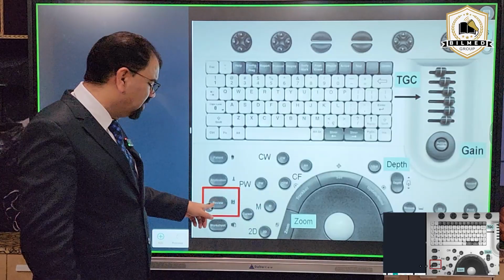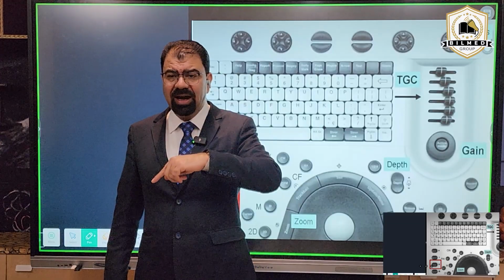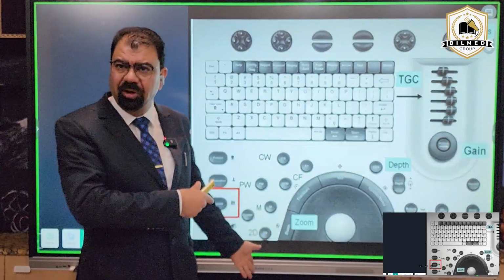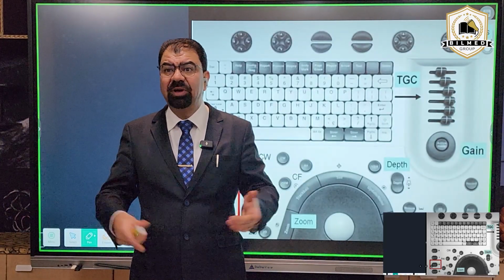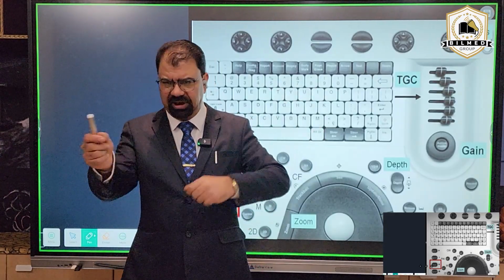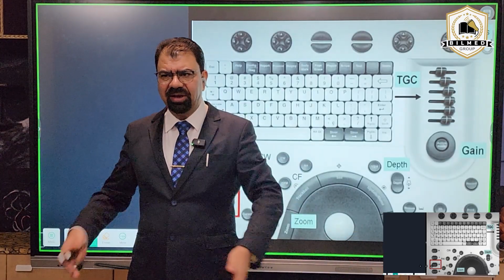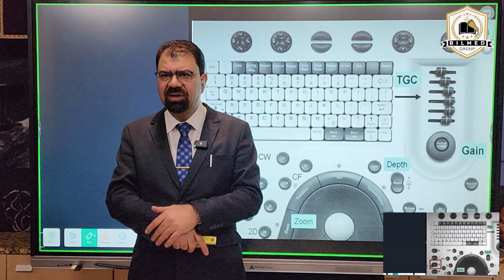Now, if you choose a preset of abdomen, try to understand. If you choose a preset of abdomen, you will tell me, why should I? But when you are pressing haphazardly here and there, there are chances that you are hitting that preset without actually intending to. Then you are searching for the CRL. Why is it not coming over there? I have to take a CRL. You have accidentally given a command to the machine, I am about to scan the gallbladder, liver, pancreas, spleen. The machine is born blind. The machine is obeying your commands, and you are searching for a CRL over there.